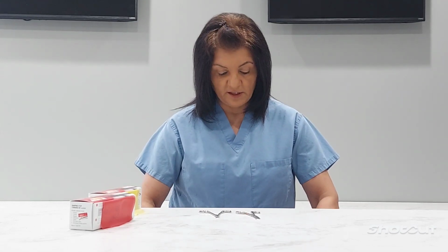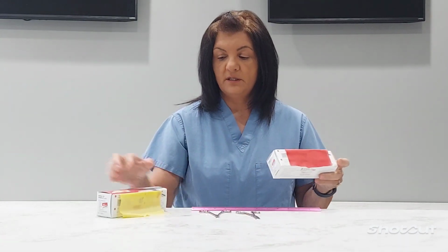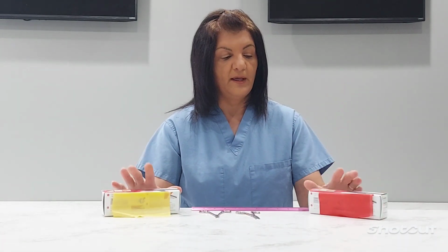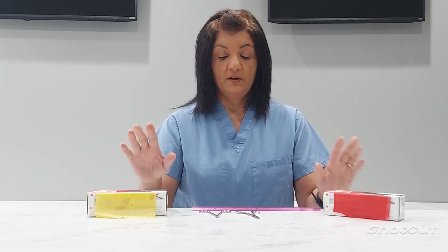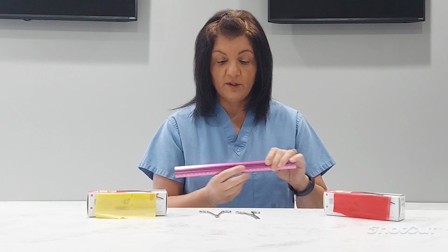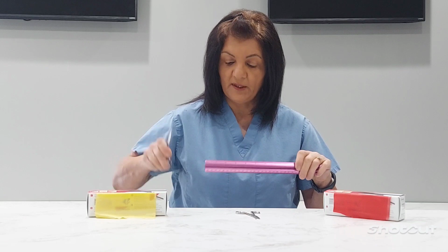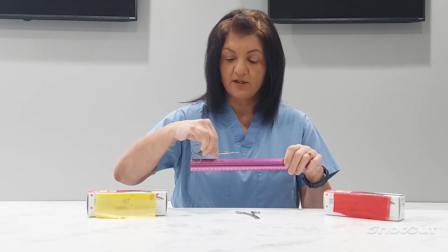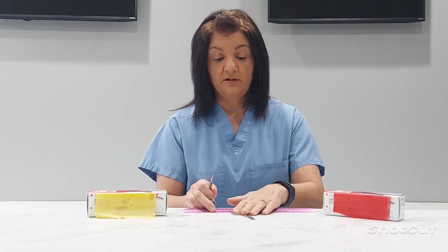Now, the way that we test our scissors is, first of all, the scissor testing material comes in 2 different colors. So let's talk about that for a minute. The reason it's 2 different colors is because the yellow is for scissors that are under 4.5 inches long, and the red is for scissors that are over 4.5 inches long. So I have a simple ruler. What we want to do to measure our scissors is measure from tip to tip. So if we put that up against our ruler, these measure actually 4 3/4 inches. So I would use the red testing material.